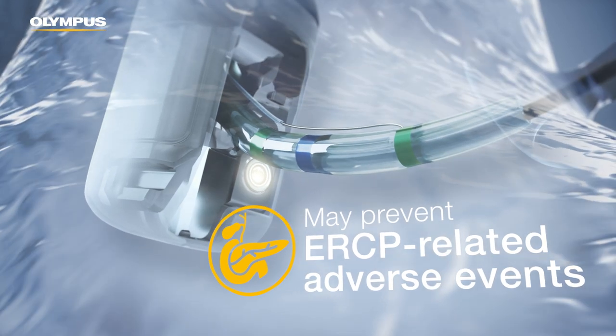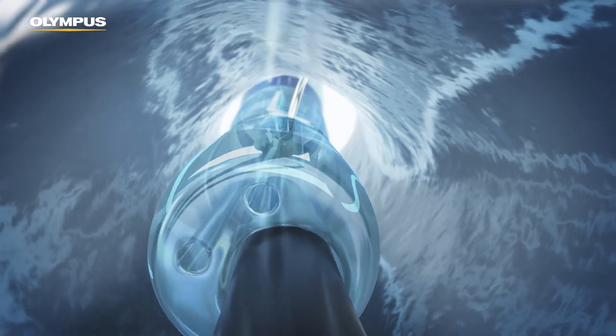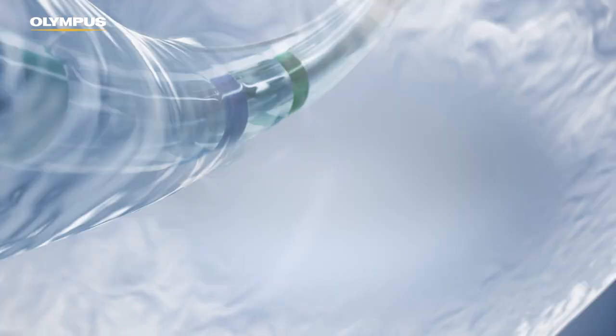This is in order to avoid potential adverse events such as post-ERCP pancreatitis. This can be supported with our access devices.